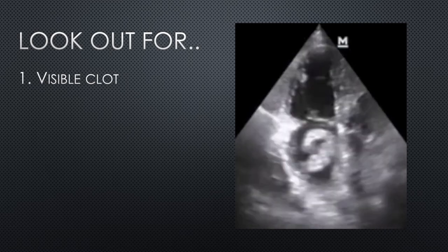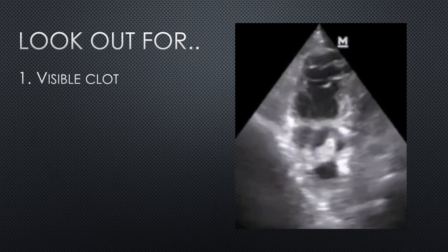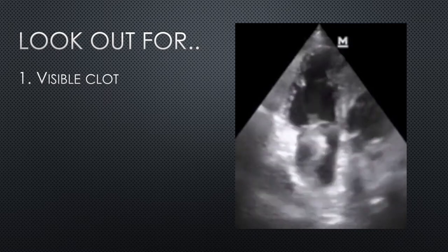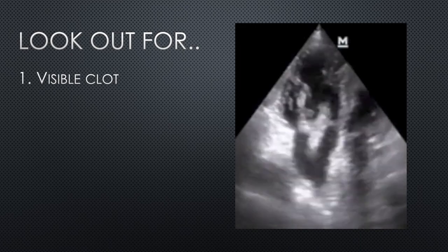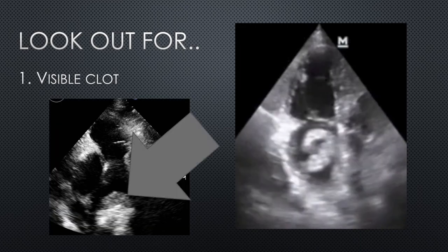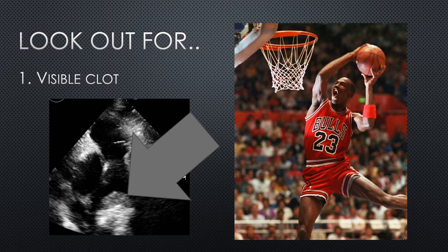Next, there are a couple of things to keep an eye out for. Firstly, a visible clot. In this video we can see a sausage-shaped clot desperately trying to escape from the right atrium. And in this still image we can see a saddle embolus just sitting here at the bifurcation of the pulmonary artery into the main pulmonary arteries. If you see one of those, that's really a slam dunk.